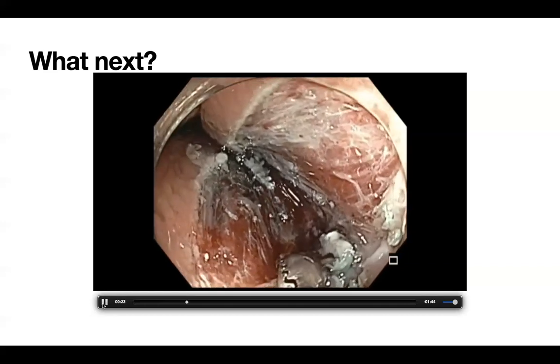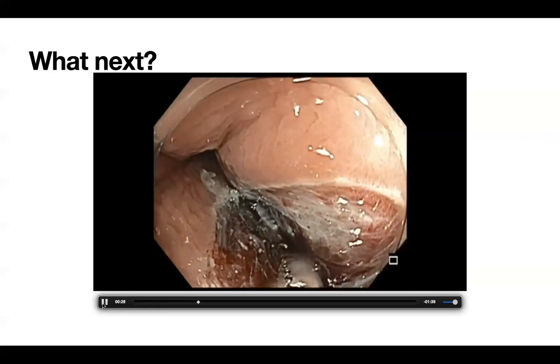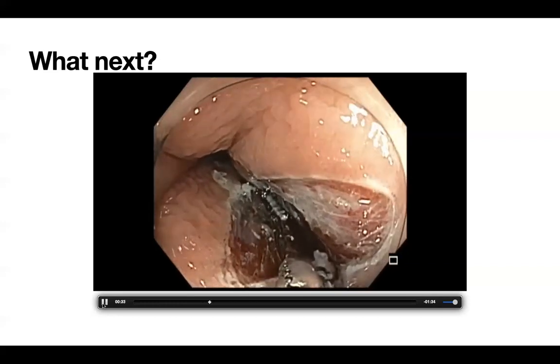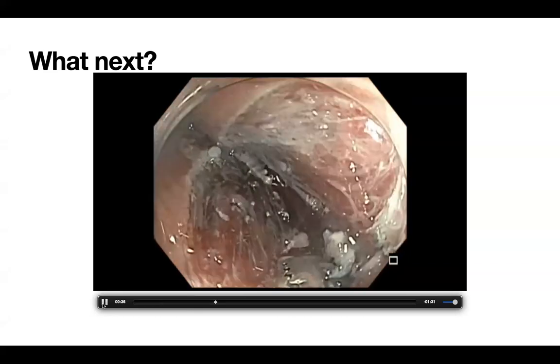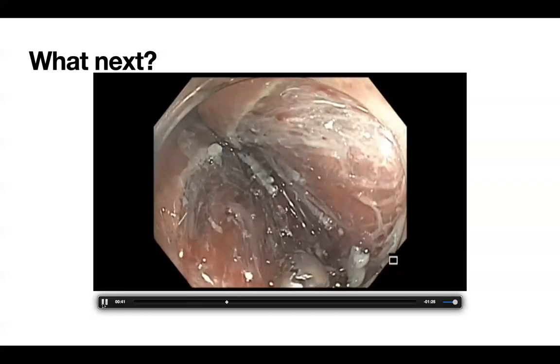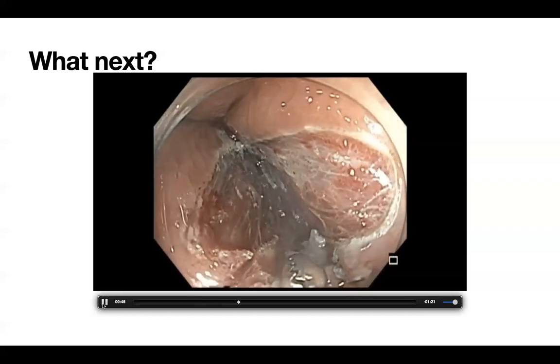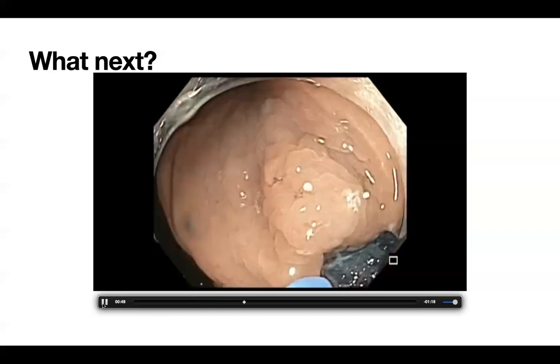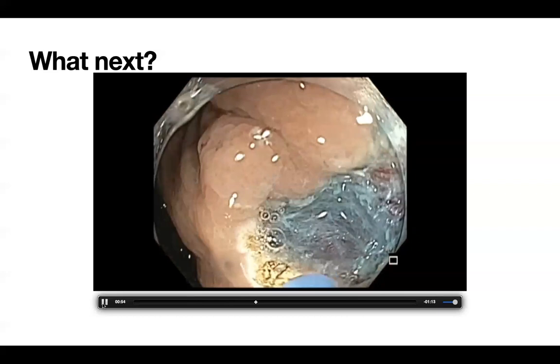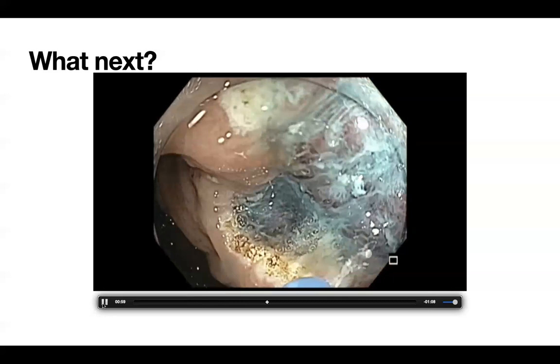So you are talking about not just the APC of the margins, but also the surface. Correct. What are your settings going to be? The APC 30 watts, at 1 or 1.5 liters. Okay. And maybe finally you can then expand this rectum and take a look. All of these vessels could so easily be done quickly. All right. So I think it's a good idea.